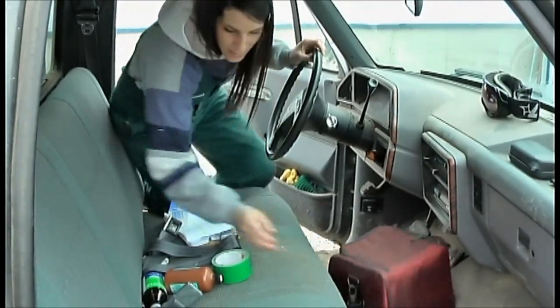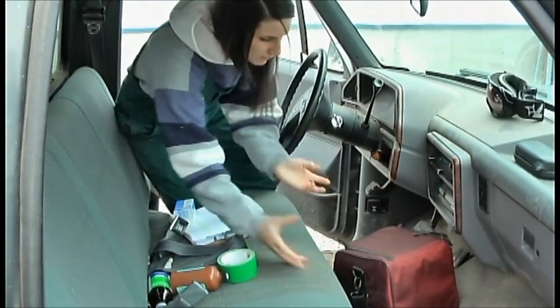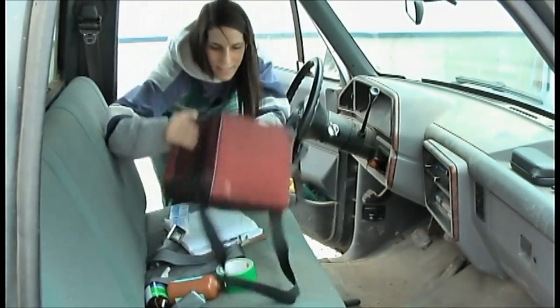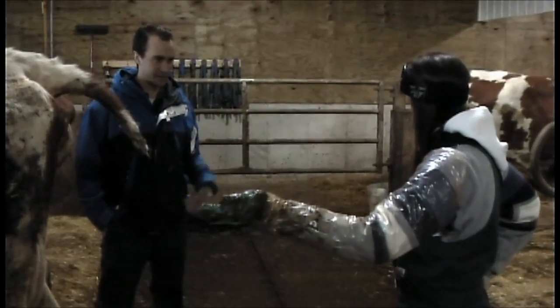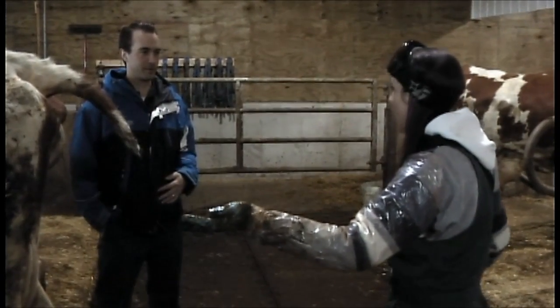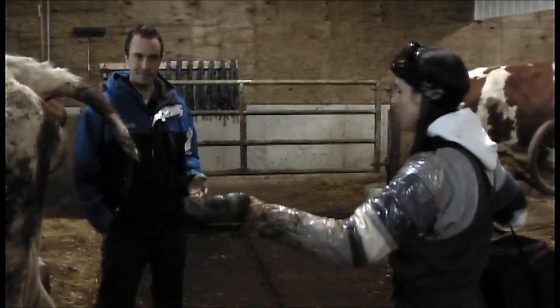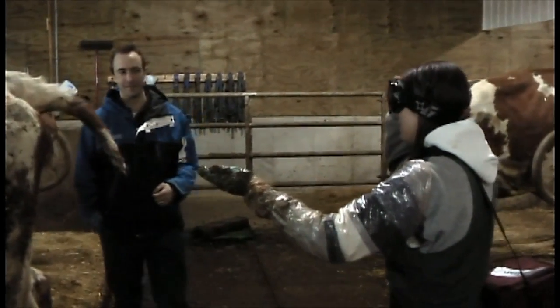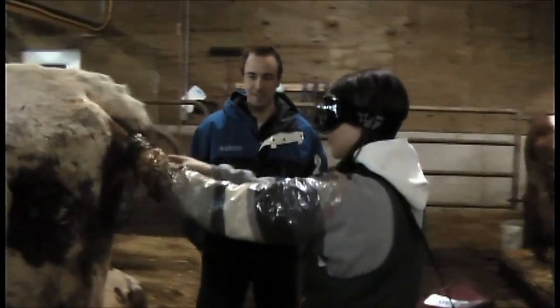I knew I should have bought an ultrasound. I just need to make a fake one. That's your ultrasound machine? Yeah, it's a new wireless technology. It's a prototype they're working on called the heart scan. Where's the probe? The probe — it's really thin, it fits under my glove. The goggles will show me the image of what I see. Alright, let's get started.